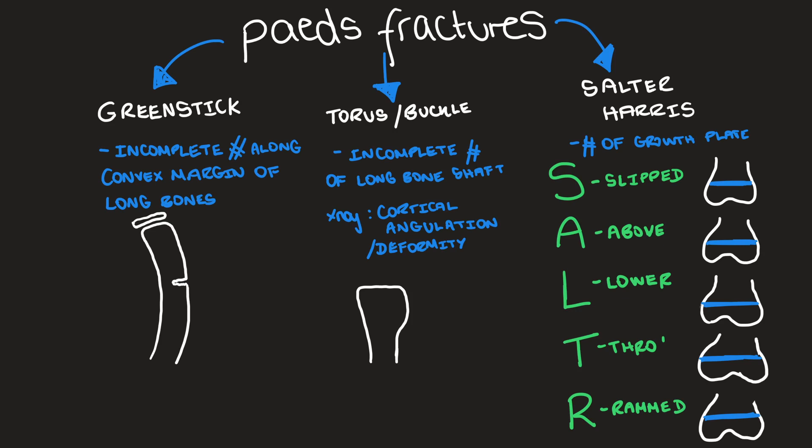Type 1 is slipped growth plate — the fracture goes through the growth plate itself. Type 2, A for above, goes through the growth plate as before but also goes through the metaphysis. This is the most common type of Salter-Harris fracture.